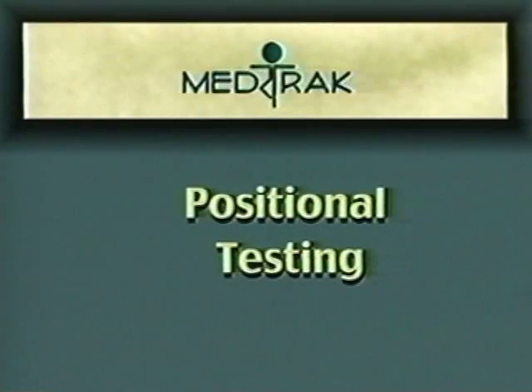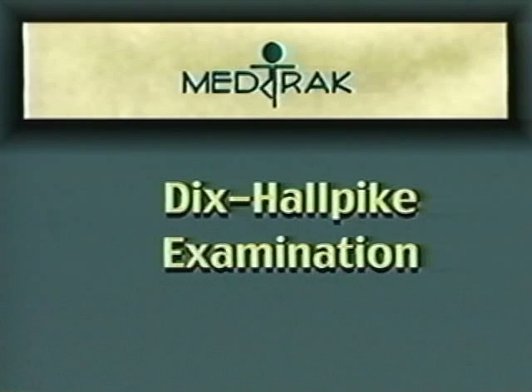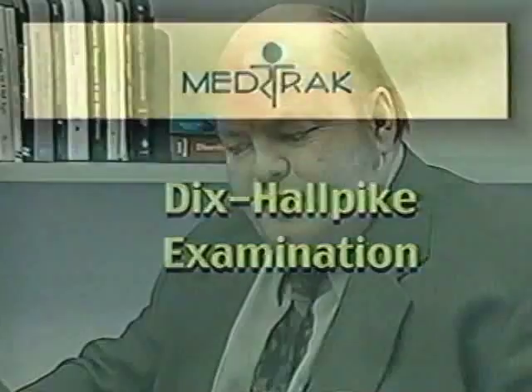The next portion of the testing battery is that of positional testing, which is divided up into several individual positions as well as a more specialized area of testing called the Dix-Hallpike examination. It is a dynamic test of changing positions. It can be done in a full lighted setting, but the eyes should always be watched and the nystagmus should be closely observed by the operator or by the physician. This is done by watching the television screen and making note of the nystagmus that's observed.